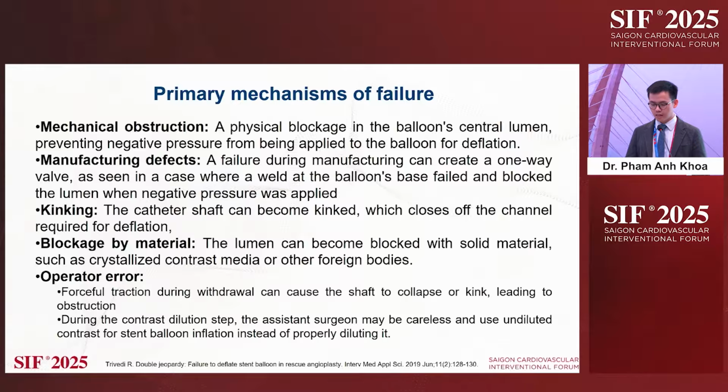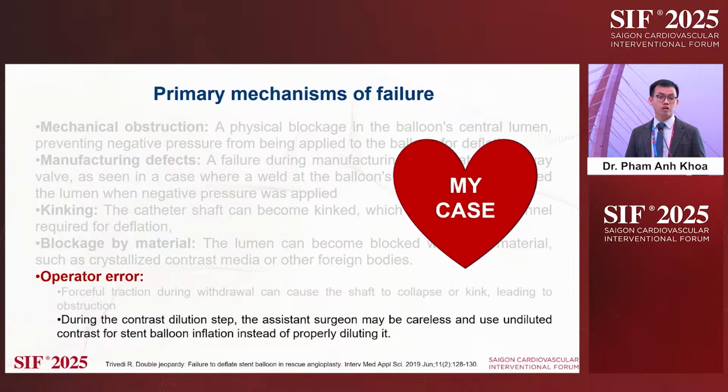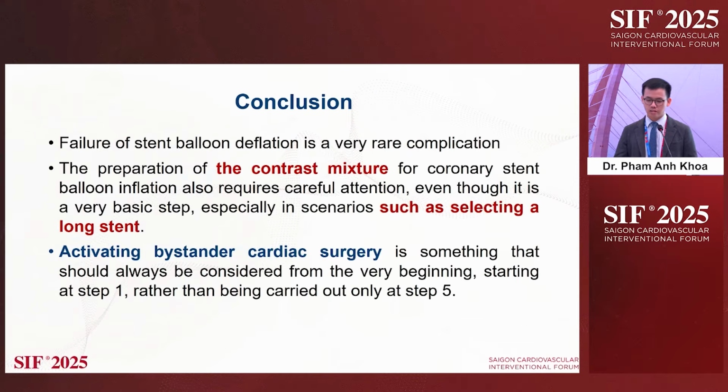And one more, I think this is the factor coming from our case: during the contrast dilution step, the assistant surgeon may have been careless and used undiluted contrast, a very dense contrast, for stent balloon inflation instead of properly diluting it. So these are some mechanisms, and my final slide: failure of stent balloon deflation is a very rare complication.